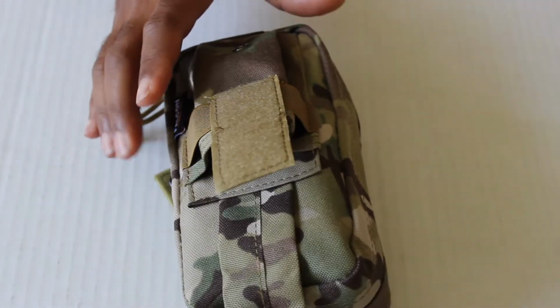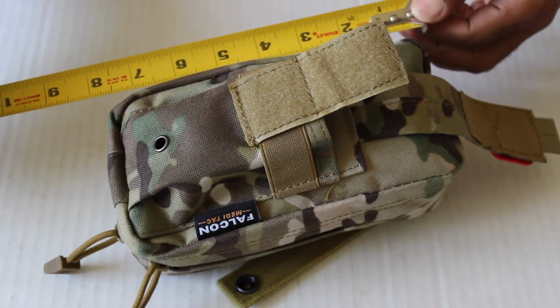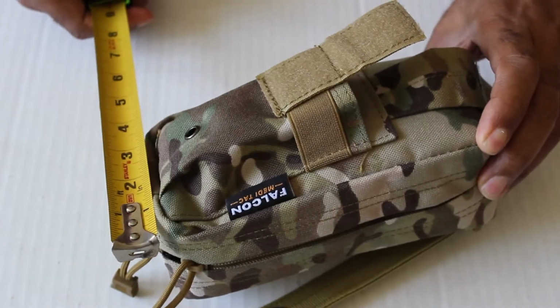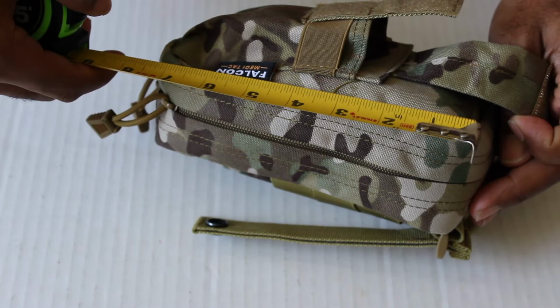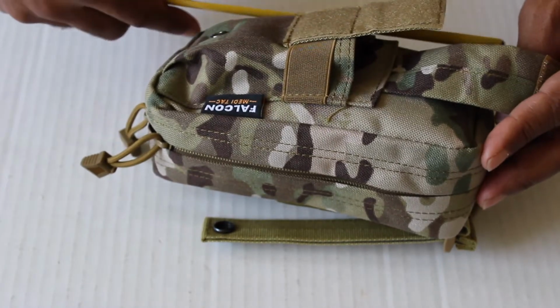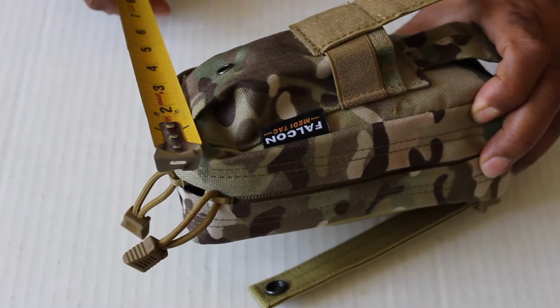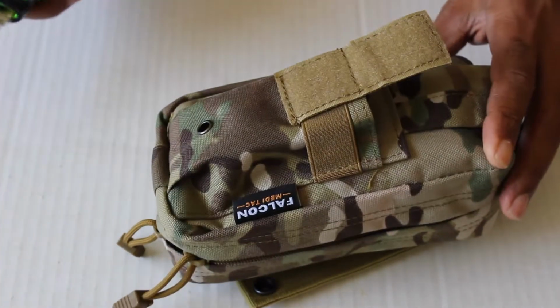Let's get the measurements on this before we go any further. You're about 8 inches by 4, so 8 inches, approximately, let's make that 7.5, approximately 7.5 by 4.